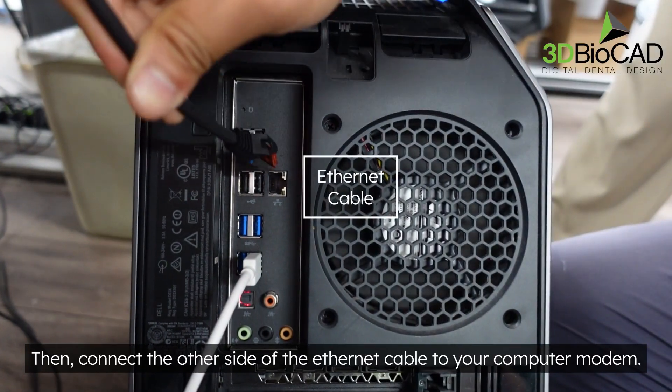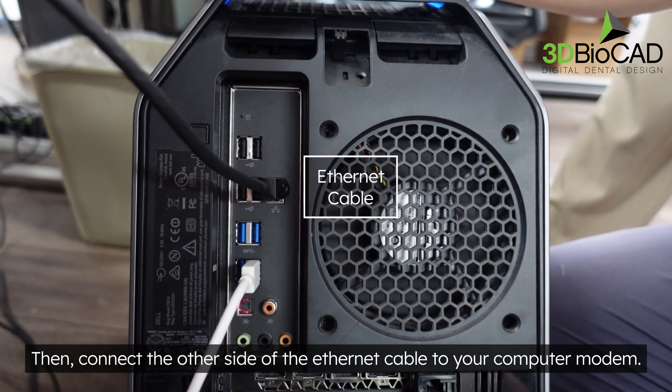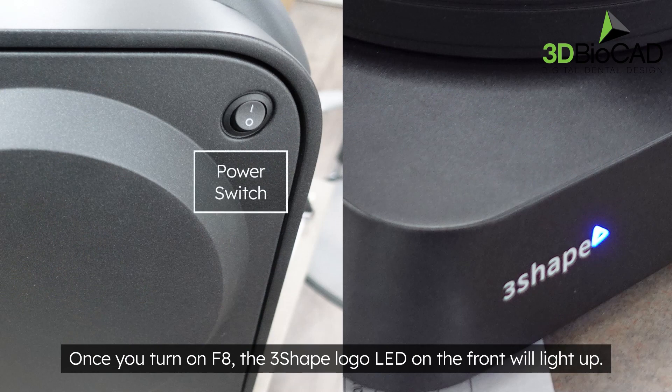Then connect the other side of the ethernet cable to your computer or modem. Once you turn on the F8, the 3Shape logo LED on the front will light up.